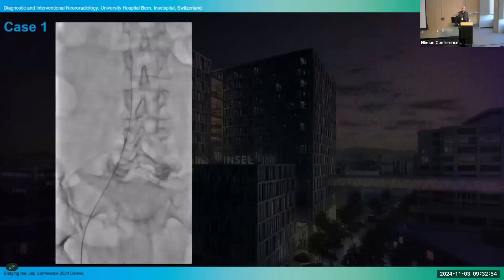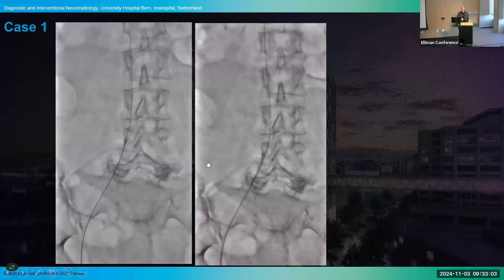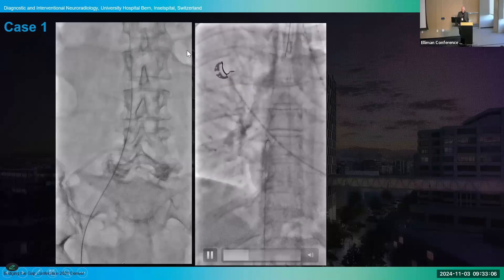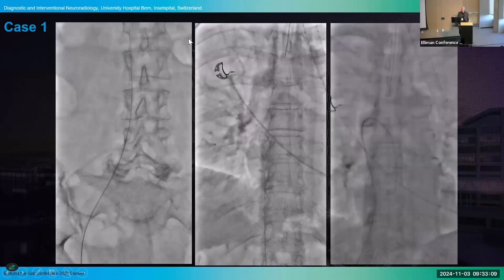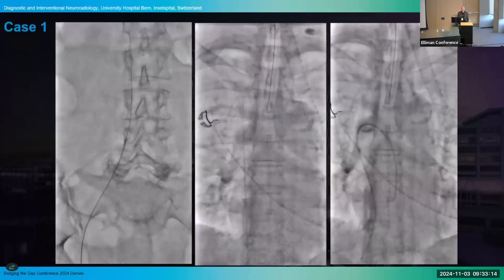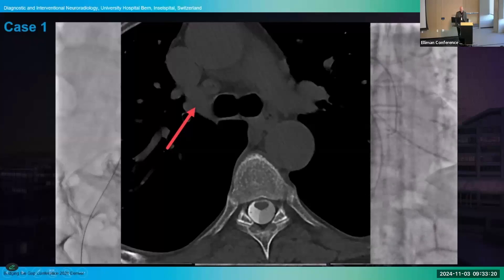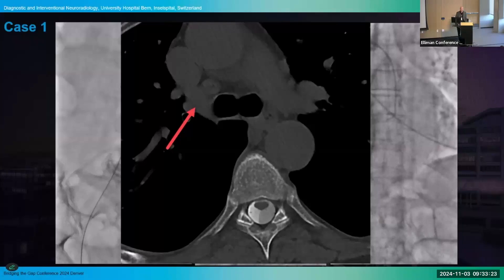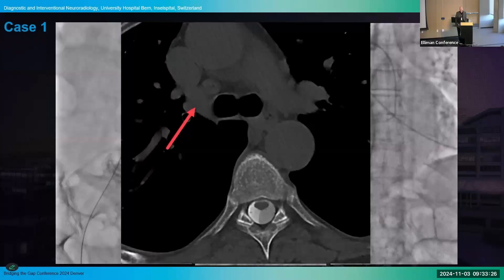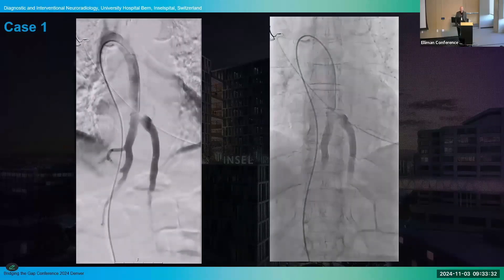Now that you know where you have to go, you just have to get there. We do a transfemoral access through the vein and advance our catheters and wires upwards through the right atrium of the heart, then go to the azygous vein. The good thing is we know where the azygous vein is, because we always perform myelographies in these patients and can have a look at where the origin is, then just go in there with the wire. This is pretty straightforward. Afterwards, we mostly do a venogram just to see how the anatomy looks.